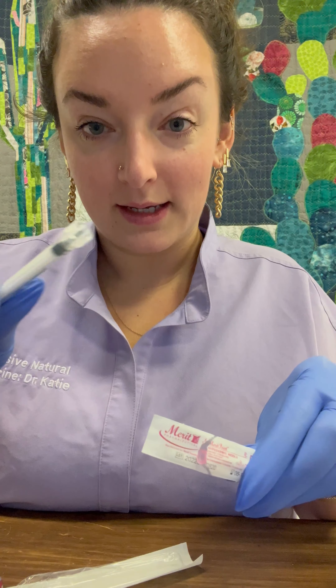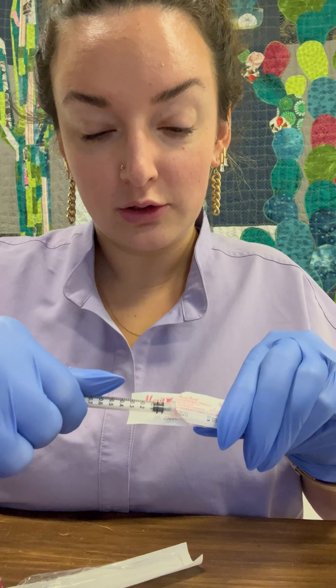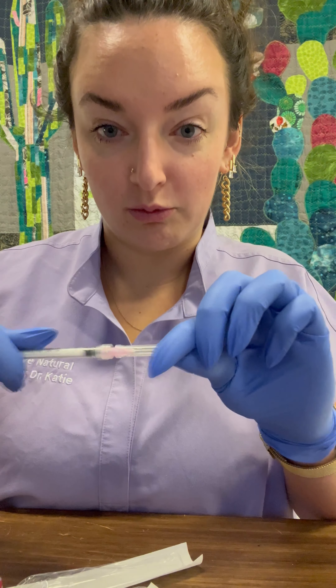You should have received 18 gauge needles. They're pretty big. You will not inject with this — don't worry about the size. Open this. These twist on to each other. Twist, remove, and remove the cap.